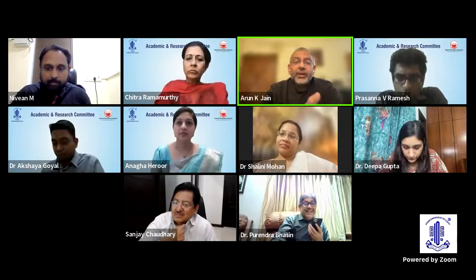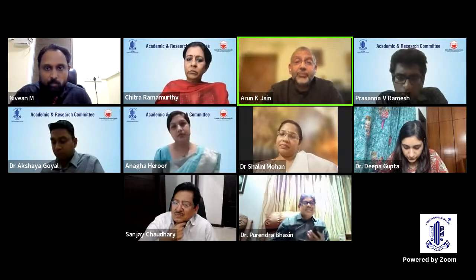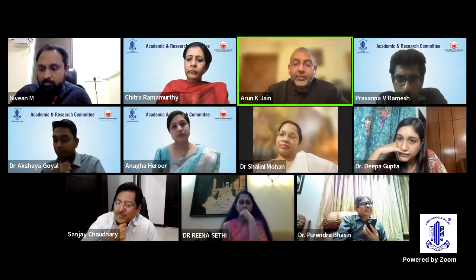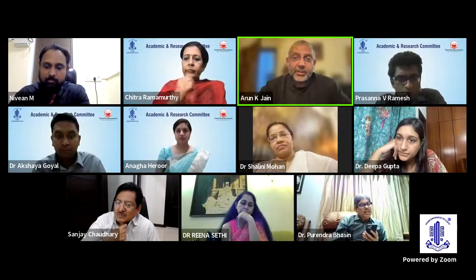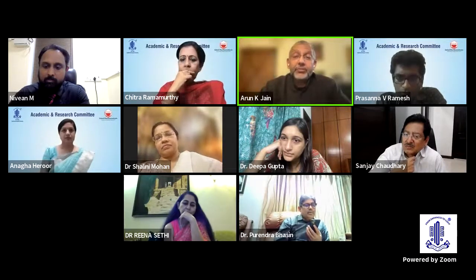We have published a series also, with not a single case of Argentinian flag sign. And in your case, as we could see, there are 4 types of white cataracts. I won't go into detail. You can read the paper by Dr. Tityal. He has given even an OCT classification. So even in your case, once you made a nick, there was no egress of fluid.